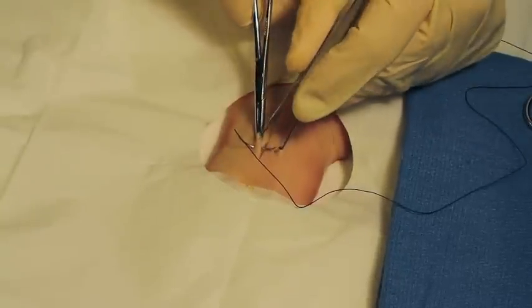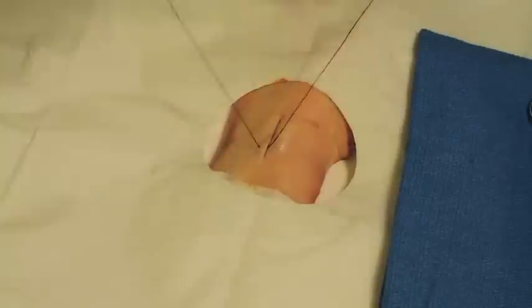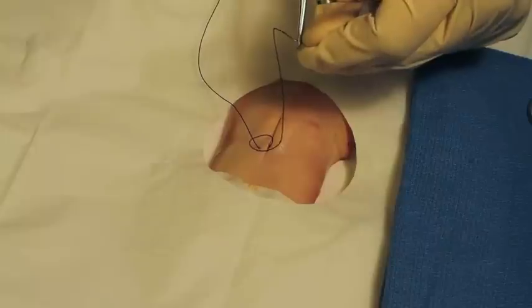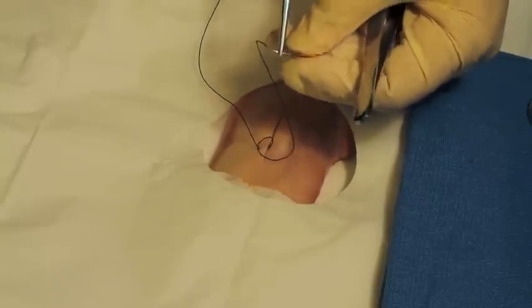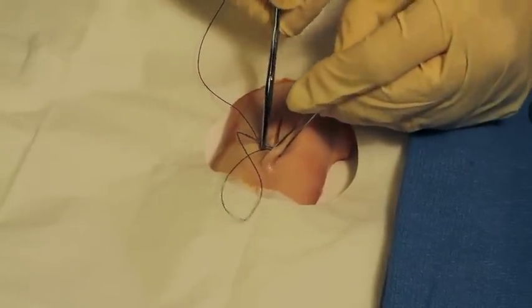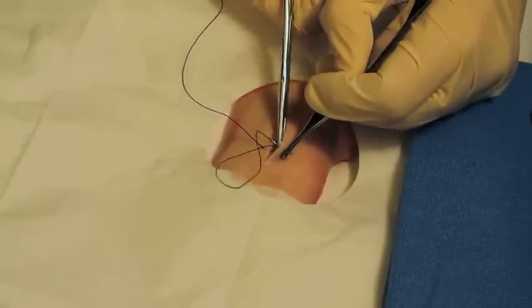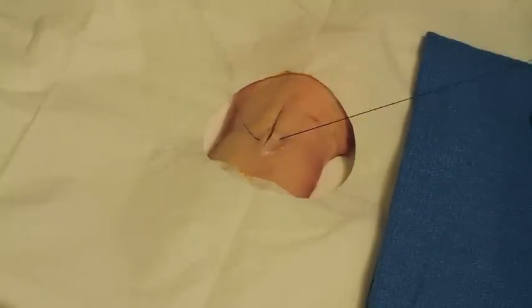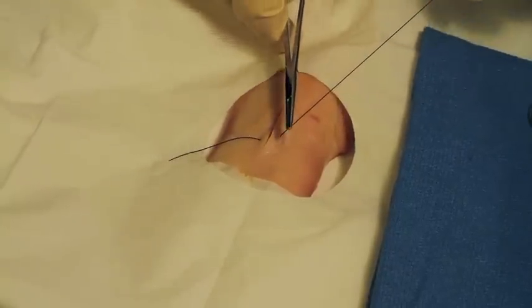Grab it with the forceps and help pull it through a little bit, then grab it with the needle holder. Pull your string through, replace your needle in the appropriate position. Now grab the other side of the cut — same thing, 90 degrees — and drive on through. Human skin will be easier than this; if you can do this you can do human skin. Grab it with your needle holder and pull all the way through, leaving maybe about two or three inches. Remember, this is a collapse situation — we have to save our suture material.